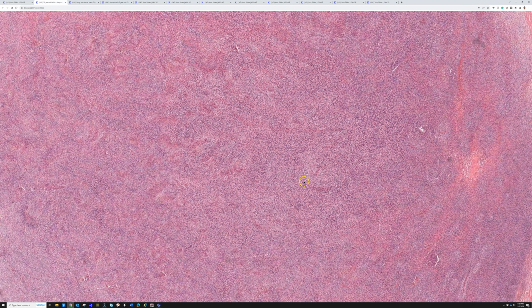It's a good thing to recognize, because this pattern right here is quite interesting, and I would say kind of unusual for soft tissue tumors. And if you had it on a small needle biopsy, you could even be tempted to think about maybe a carcinoma, like say lobular breast carcinoma, infiltrating background collagen or something like that.